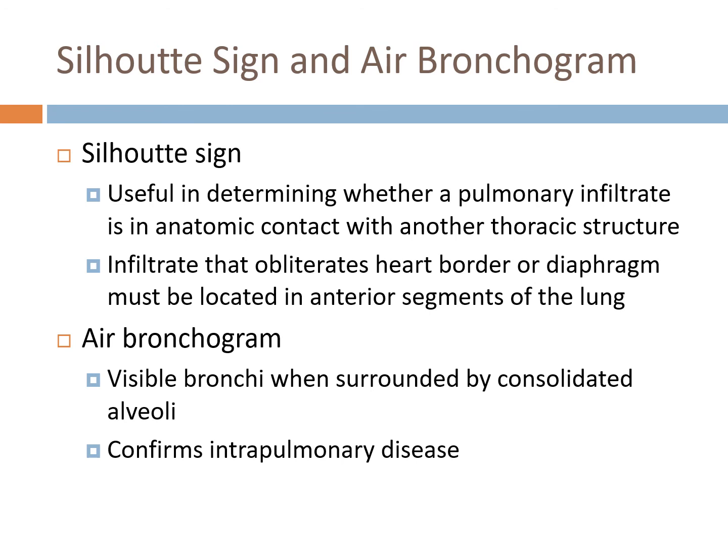Okay, so a silhouette sign indicates that there's probably some type of consolidation, a pneumonia, in that area. So the infiltrate obliterates the heart border or diaphragm, generally in the anterior segments of the lungs.